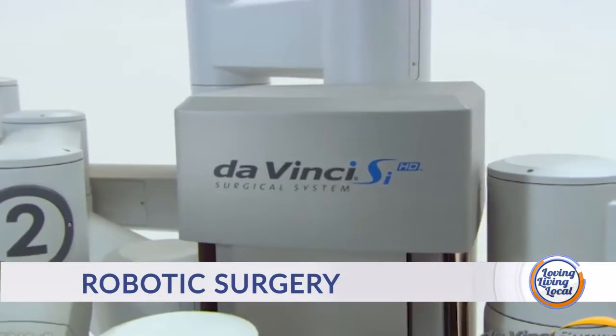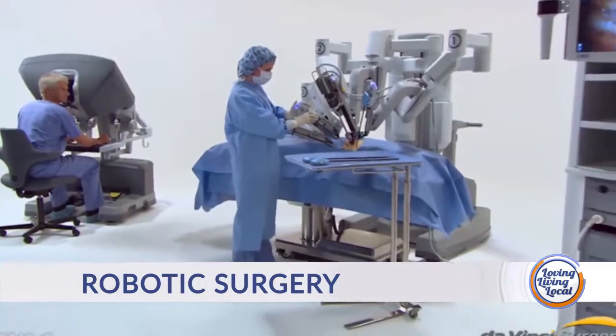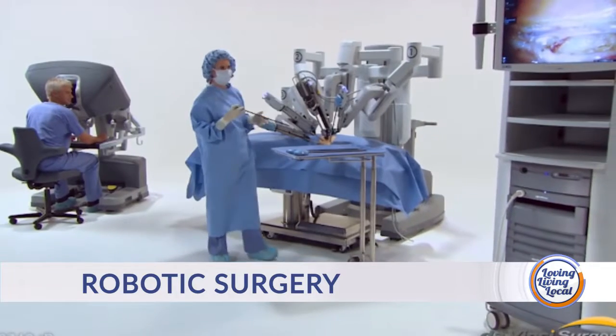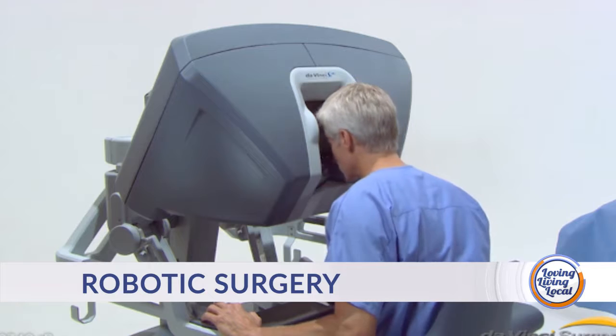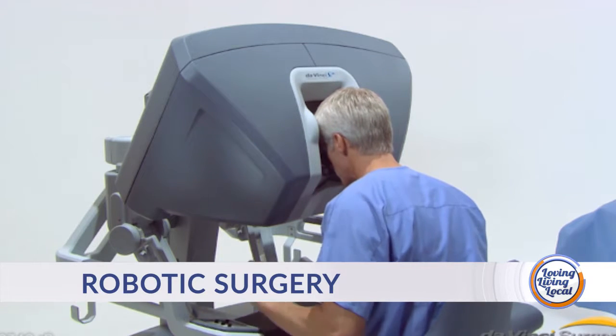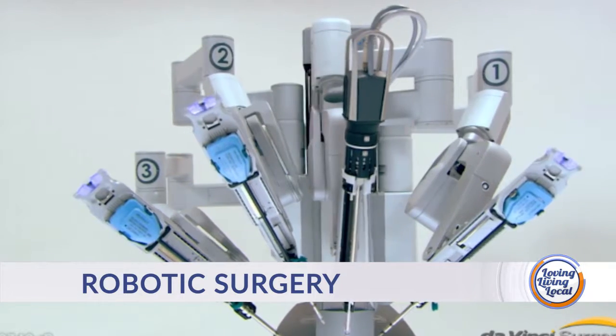So what are some of those procedures? Sure. We treat various oncologic cancers, urologic oncology cases. That includes kidney cancer, bladder cancer, prostate cancer, of course, and then we also use the robotic system for benign processes, for things like ureteropelvic junction obstruction, or when we do a pyeloplasty, or sometimes if we have to re-implant the ureter into the bladder for strictures. So there's a variety of surgeries that we utilize the robot for.